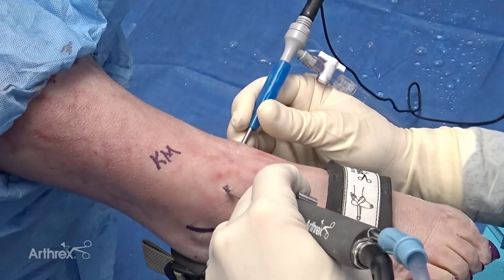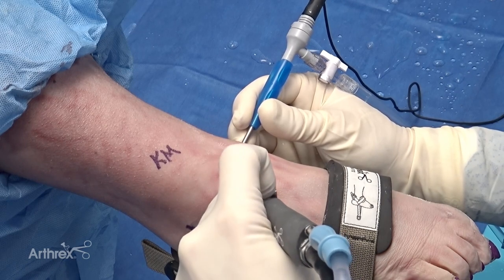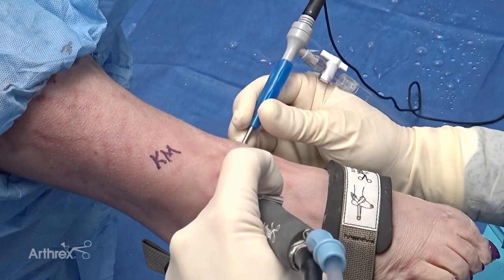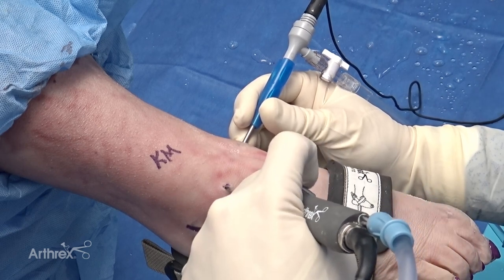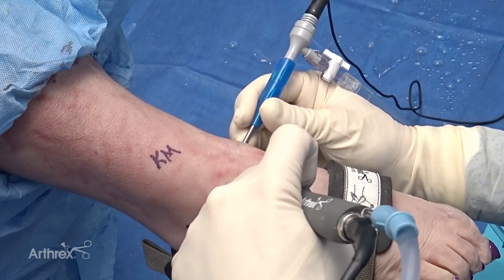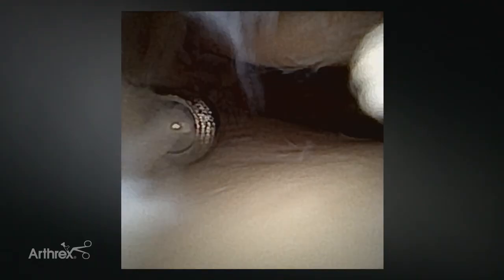Another advantage of the small shaver is the hand piece — it's much smaller than the standard large hand piece, which allows the surgeon to use both simultaneously. Having a small pencil grip in one hand and a large shaver in the other doesn't make much sense, so switching to the new smaller lightweight grip provides that equal control and balanced approach as you navigate a complex small joint. It's very movable and agile inside the joint.